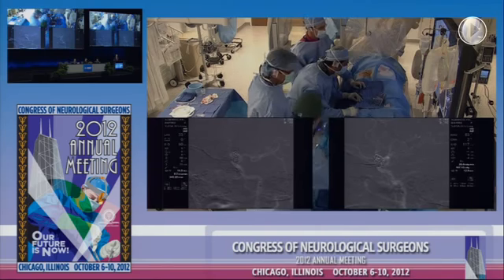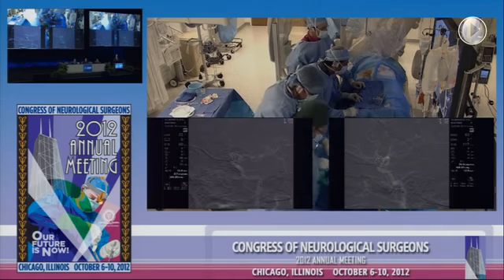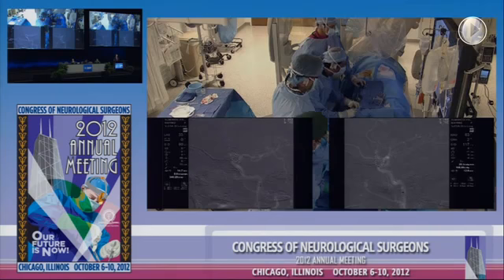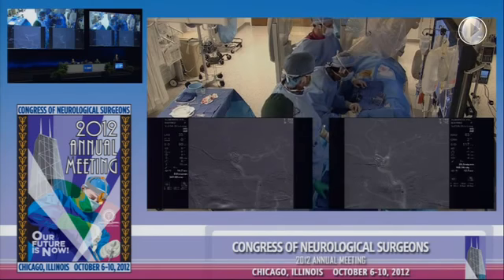and we do what we can to avoid stenting in a subarachnoid setting. We're several weeks post. Most of her stuff is out or at least is in right now. We want to definitively treat this before she's discharged because it is a rupture. Right, that was the point I was getting at.